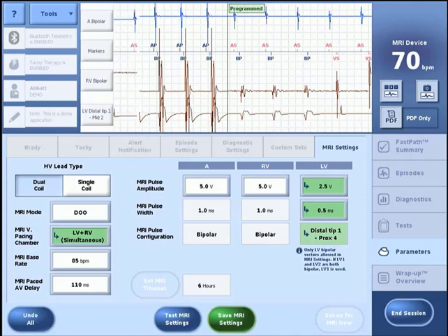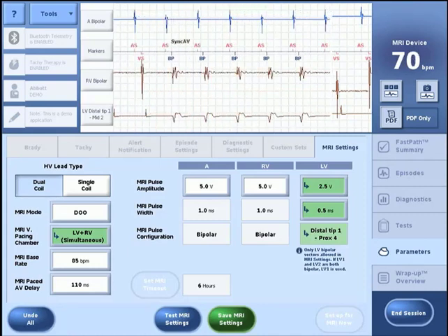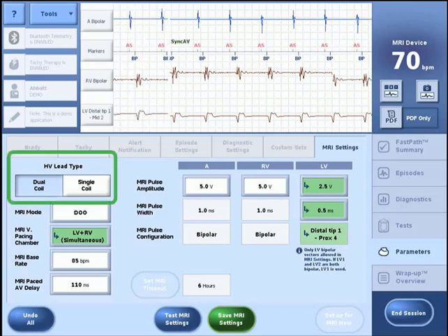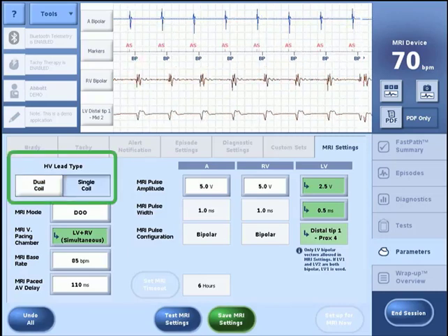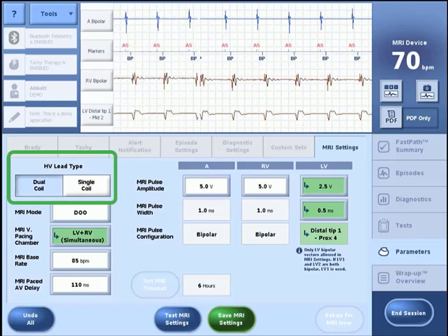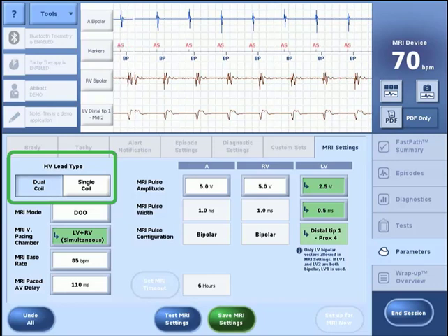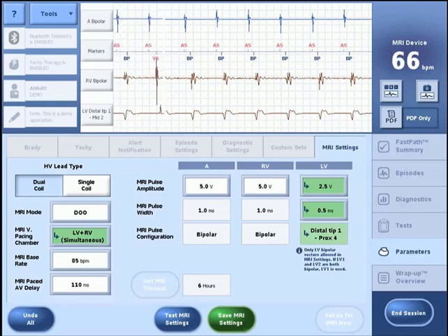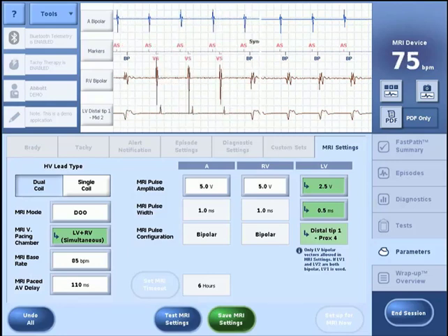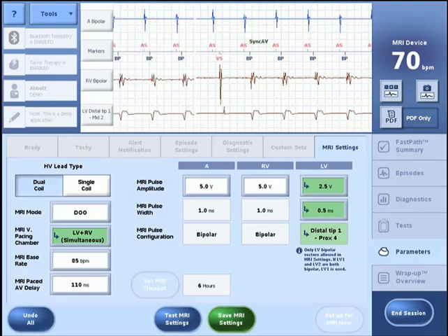After selecting and testing the MRI pacing parameters, the next step is to select the high voltage lead type implanted: dual coil or single coil. It is important to select the correct lead type, which may be different than the lead configuration. If the implanted lead type is a dual coil lead but the SVC coil has been turned off, dual coil would still need to be selected as the lead type. This will ensure that the high voltage lead impedance test is performed correctly during MRI setup.